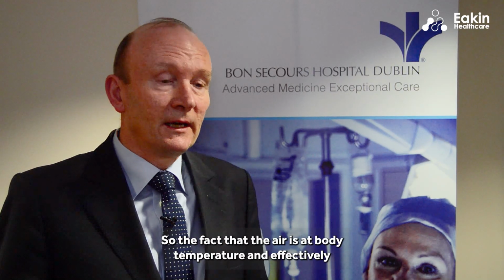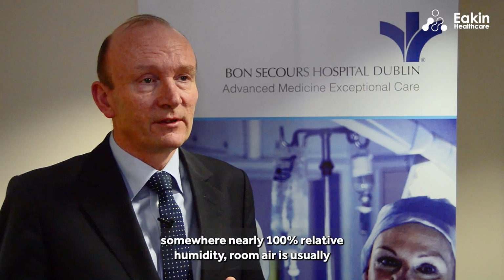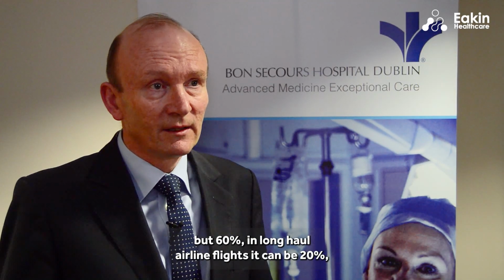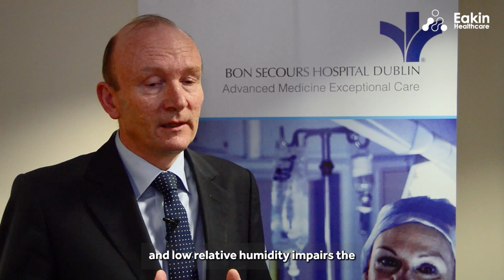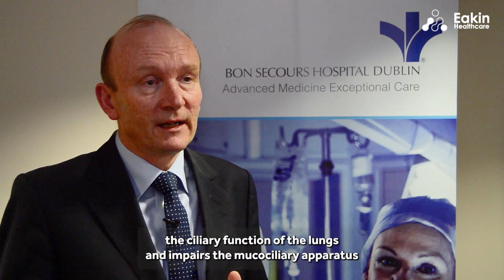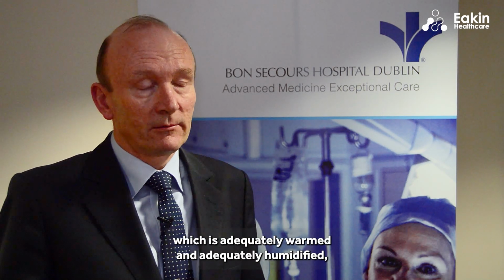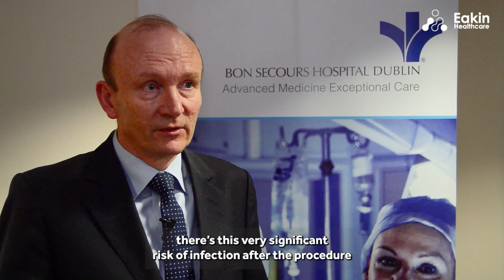So the fact that the air is at body temperature and effectively somewhere nearly 100% relative humidity, room air is usually about 60%, in long-haul airline flights it can be 20%, and low relative humidity impairs the ciliary function of the lungs and it impairs the mucociliary apparatus. And so if you don't have a high flow system which is adequately warmed and adequately humidified, there's this very significant risk of infection after the procedure.